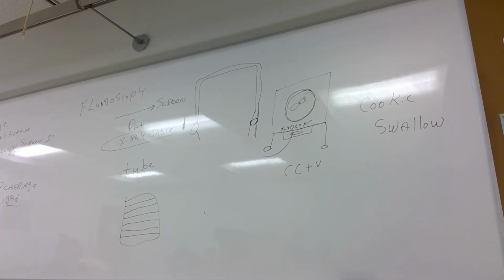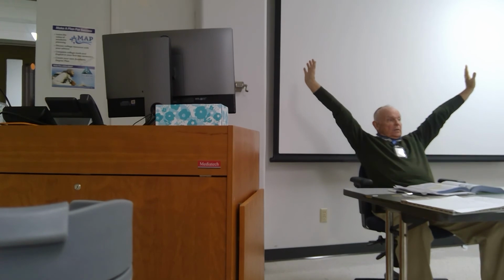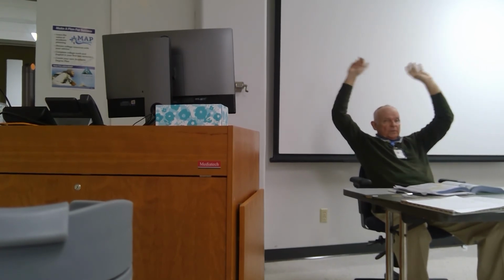So those are some of the studies we do this with. It's more exposure than taking a simple image. Okay, it's more exposure, but again, it all gets down to something we call risk reward. Okay, so any questions on this? This is how image intensification works. I thought you guys did a good job following this.